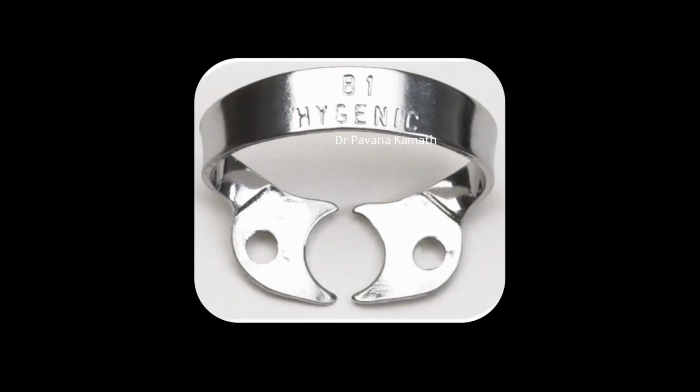Now, you have another Coltene dam kit which comes with Brinkers. Now, what are these Brinkers? Brinker clamps are not retention clamps, they are tissue retractors. They do have a little bit of retention in them, but they cannot be used as a main source of retention. So let us have a look at all these clamps.